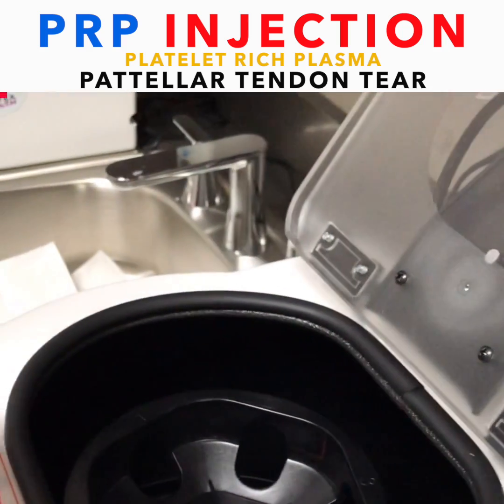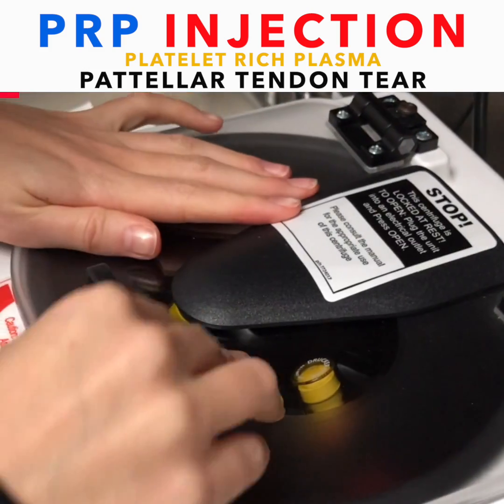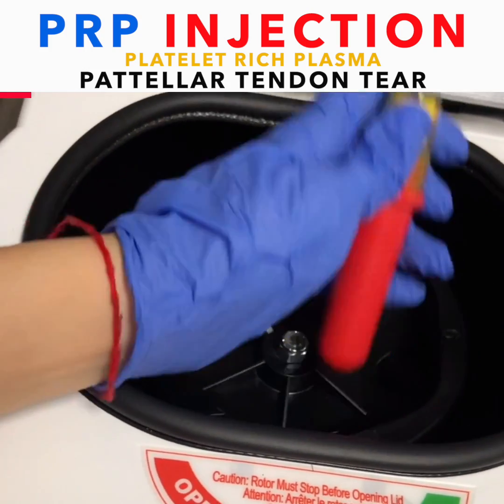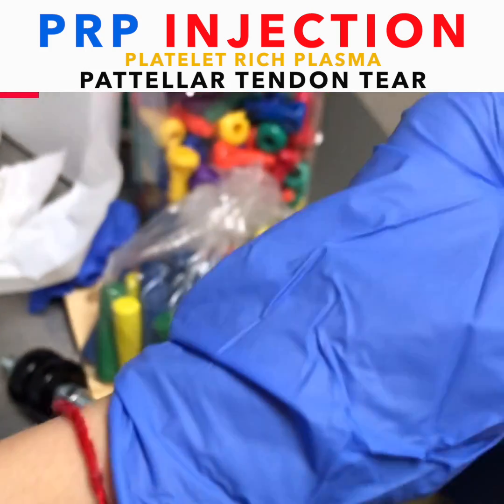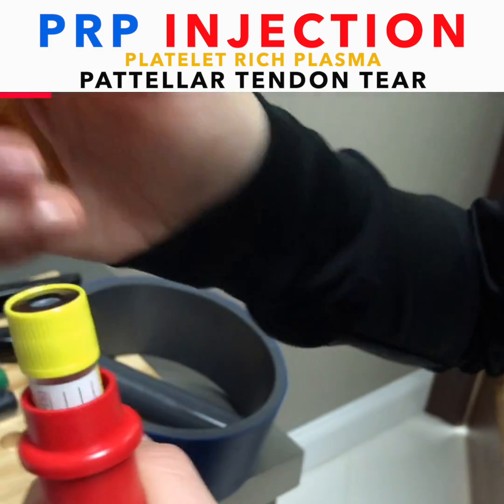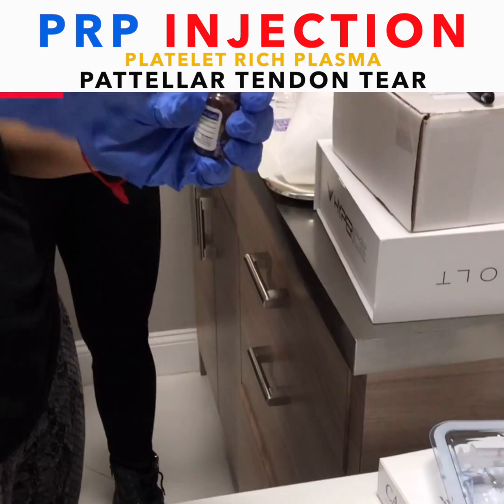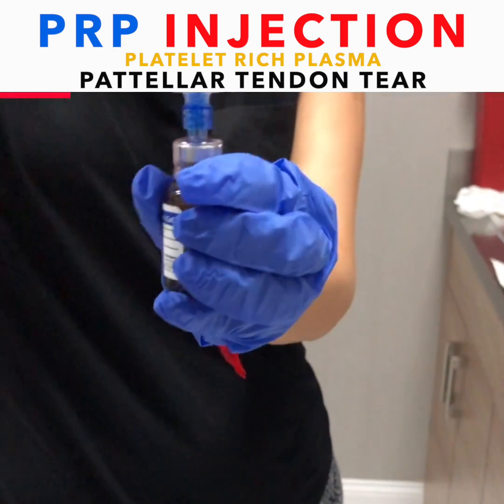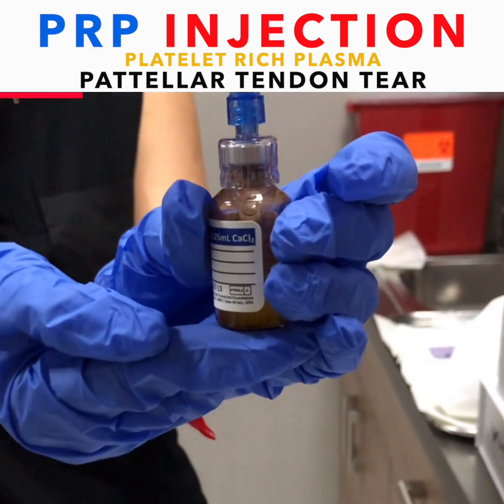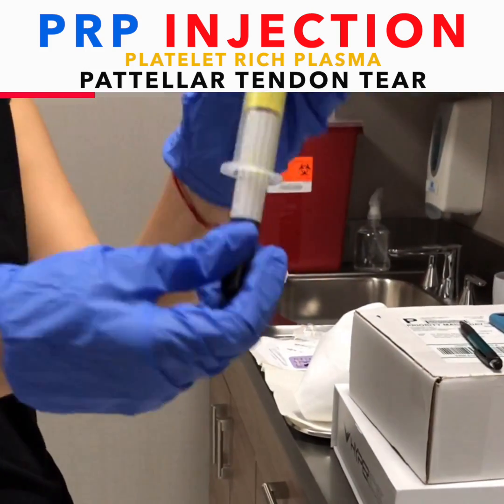We just drew up his blood and we're ready to put it into the centrifuge. Taking it out. Mixing it up.